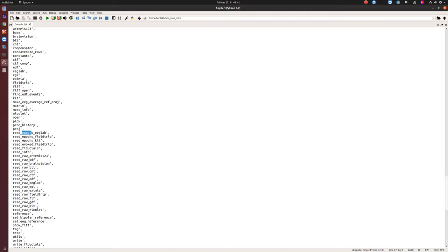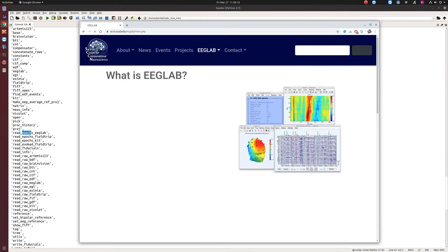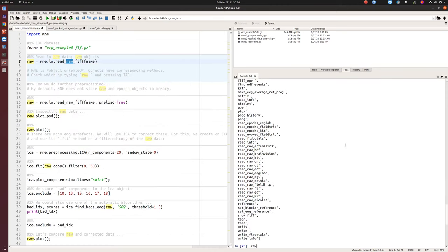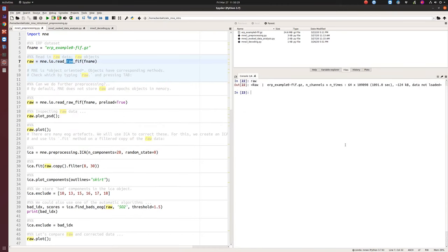In MNE, 'epochs' means segmented data — each epoch corresponds to one trial. Don't confuse this with the terminology used in neural networks or deep learning; it's just one example, one trial. 'Raw' means continuous data, and 'epochs' means segmented data. I just read raw continuous data here. We can also explore what type of object this is.